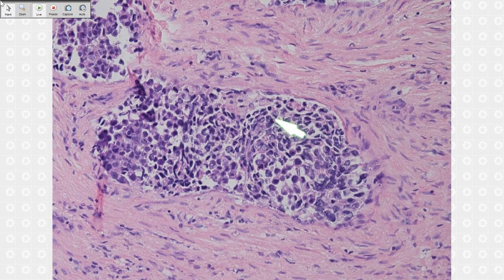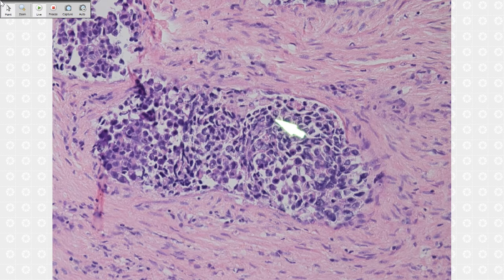Okay. So what are we going to do? We are going to do immunostains. If I do immunostain, what kind of marker should we choose? GATA3. PSA. Yeah, okay. This is GATA3, right? Positive, right? NKX.